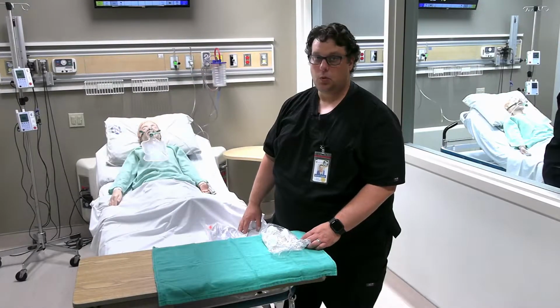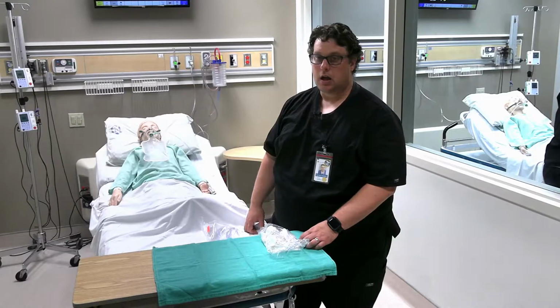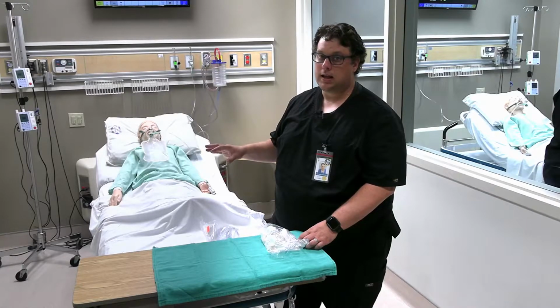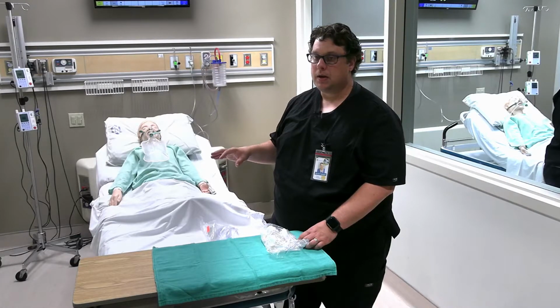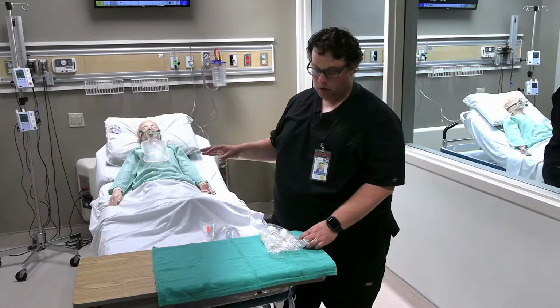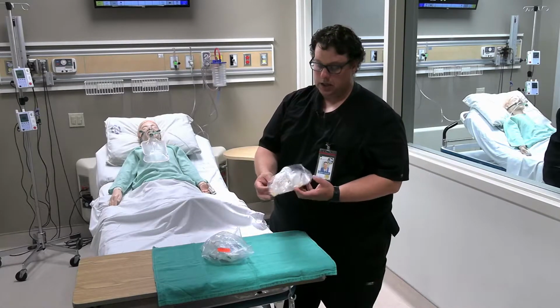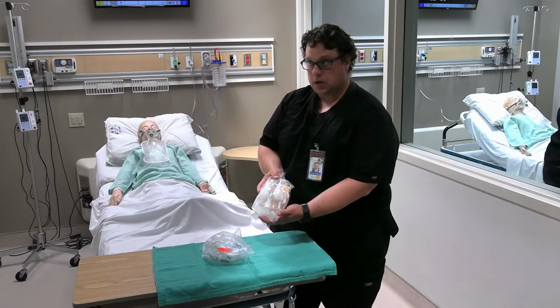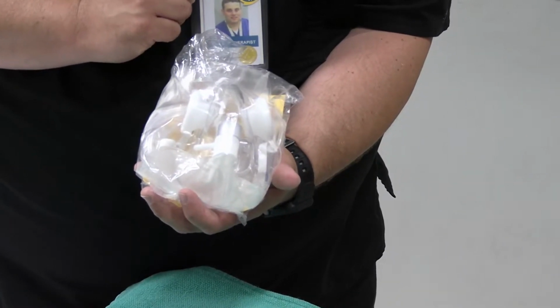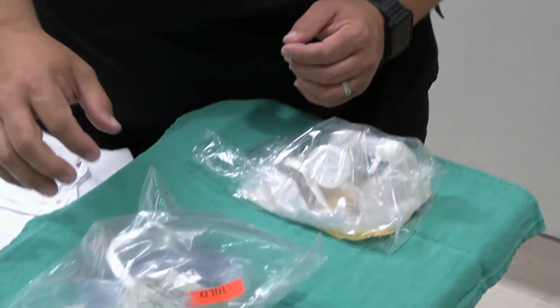So one of the things that you want to consider when using a non-rebreather, especially in our COVID world these days, especially if you are applying 100% oxygen therapy, the thought is that could potentially be an aerosol generating medical procedure. So we now have filtered non-rebreathers. So this one here is actually an adult filtered non-rebreather, which has filters attached directly to the mask, here, normally where you would have those valves on your typical non-rebreather.